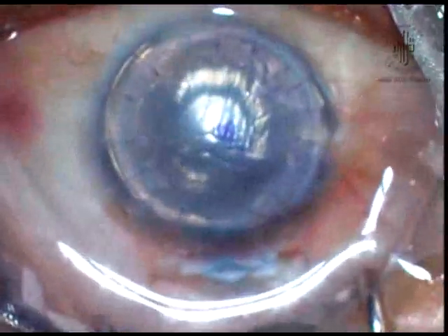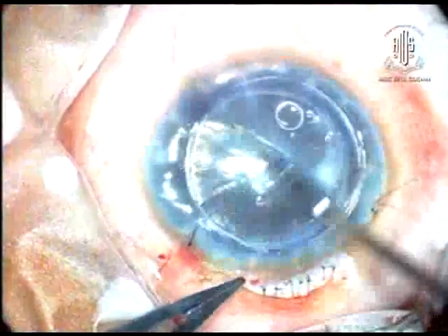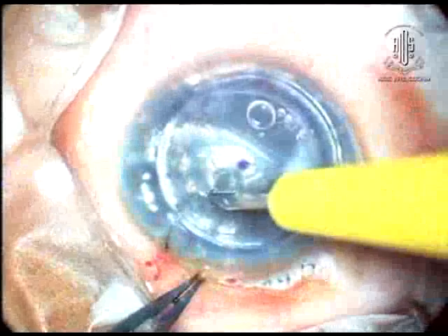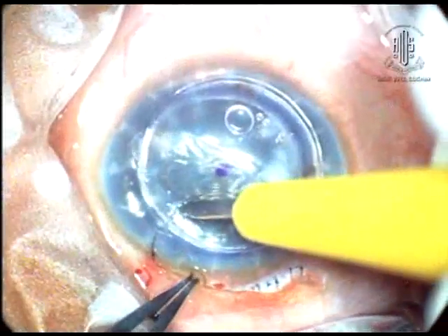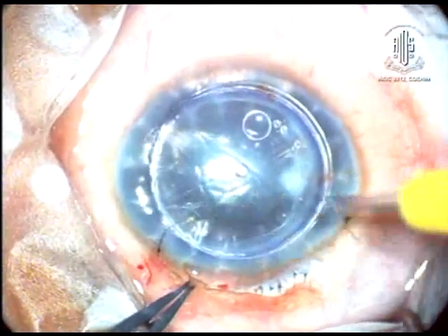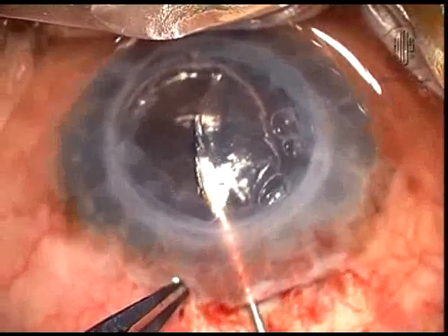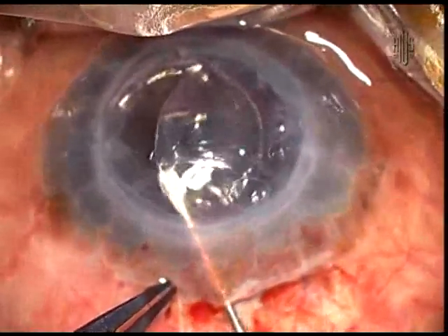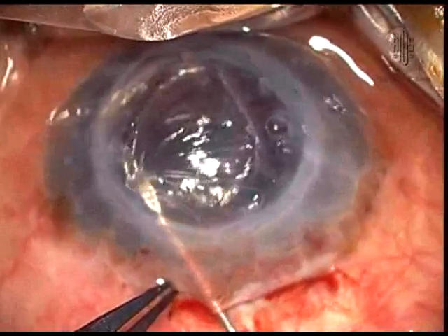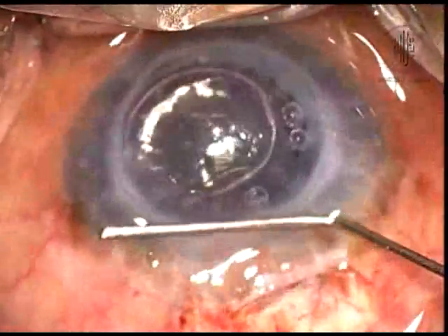It is difficult with larger graft or when there is a posterior ridge. External manipulation is best done with a side port blade, which also creates vent to release interface fluid. When the unfolded donor is shifted to one side, a 30 gauge reverse bent needle may be used through the main port to pull the tissue gently towards the center. Then gentle massage.